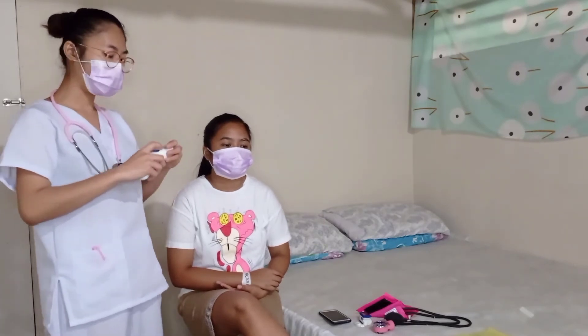You can take a patient's temperature orally, tympanically, axillary, or via the temporal artery. I'm now going to use the temporal artery method to check my patient's body temperature.